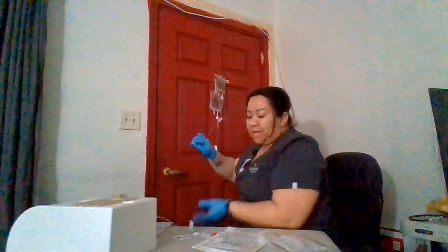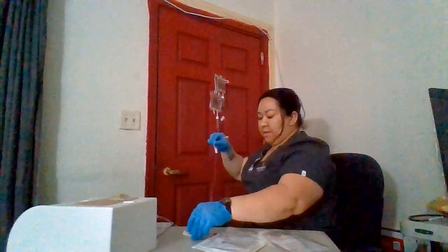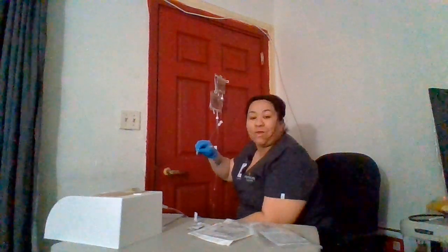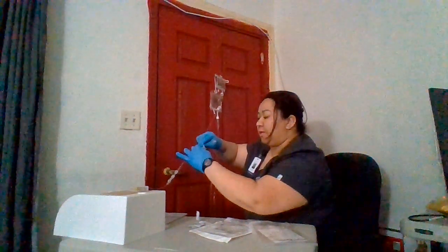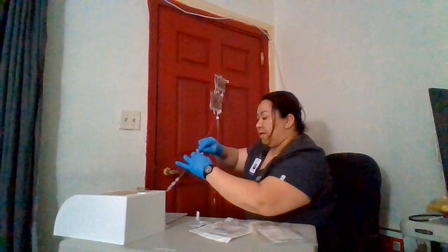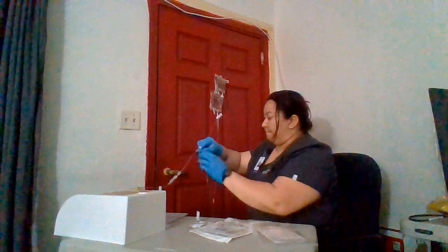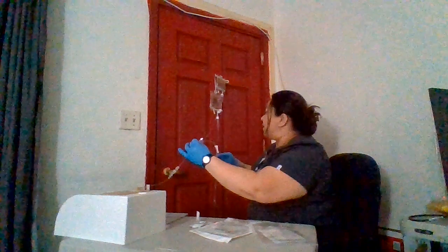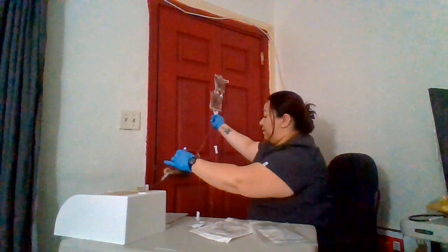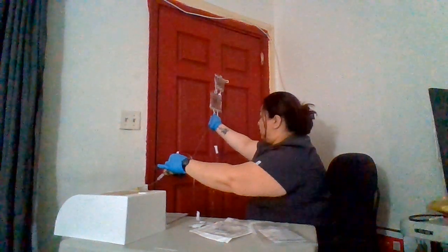So the next step is gonna be getting my alcohol prep pad, and now I will be cleaning the Y connector. Let it air dry. While the connector is air drying, I'm gonna prime the secondary tubing.